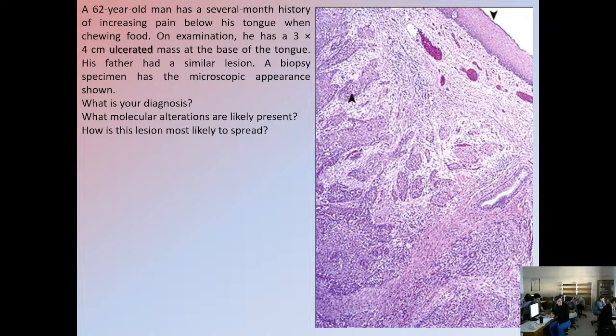is it cancerous? Then you should cut further. Is it okay? That means it's safe. In case he wants to know the distance between the cancerous cells and the surgical margin. This is of crucial importance so as to predict if the tumor is going to reappear, if he will have a local recurrence, but it is of crucial importance to see how much he can remove, how much tissue he can remove so that his excision is safe.